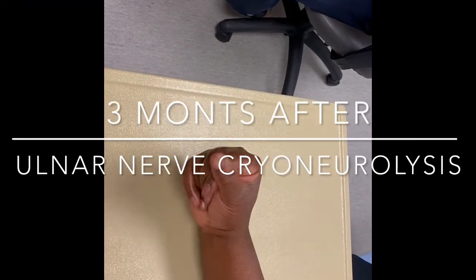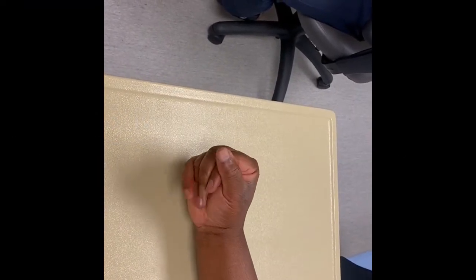We did a nerve block to the ulnar nerve with such success below the elbow that we immediately went on to do a cryoneurolysis.